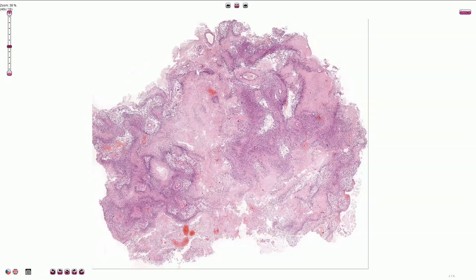It is a high-grade tumor with predominantly astrocytic differentiation. The tumor is usually necrotic, at least partially, and under the microscope we can see necrotic areas lined by viable tumor tissue.